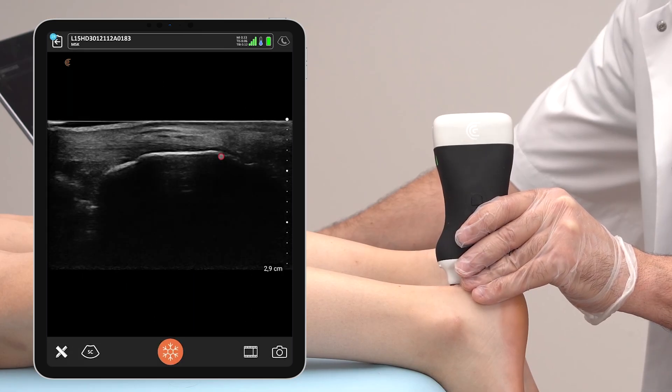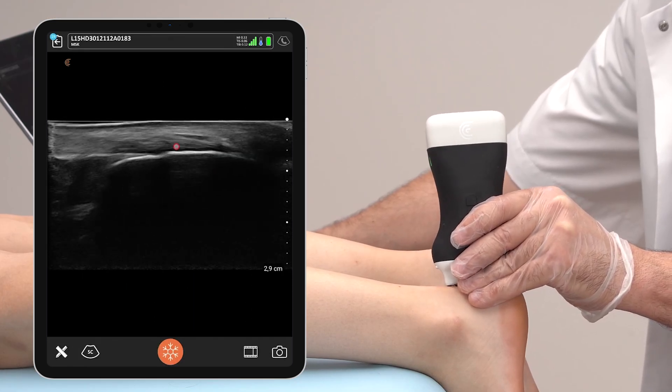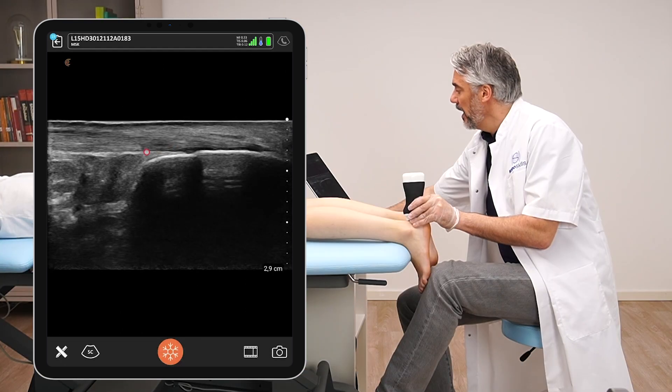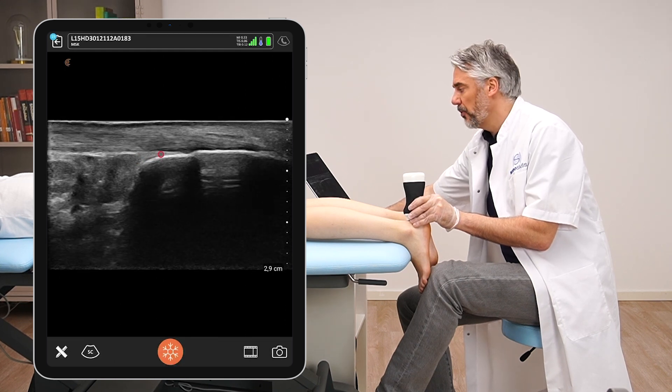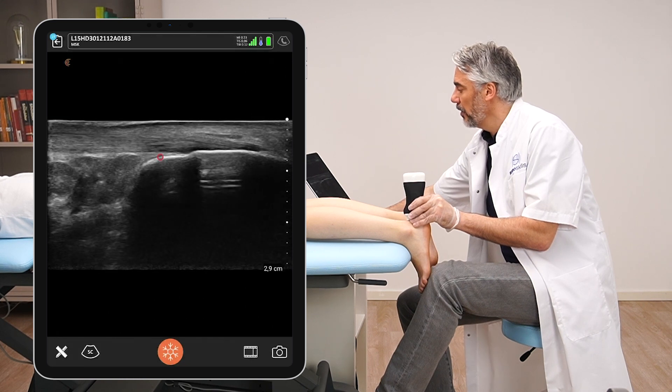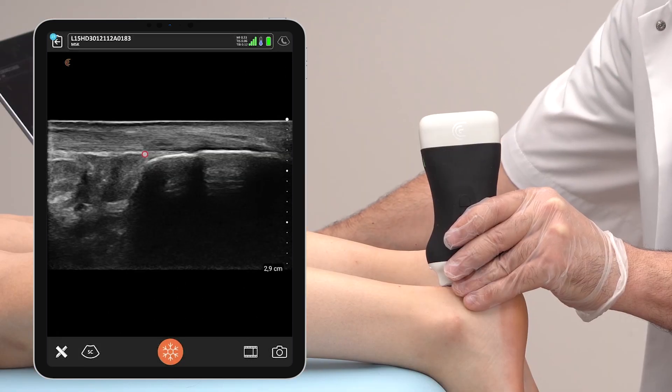Tilt the transducer from medial to lateral in order to have every fiber visualized. In this zone at the end of the calcaneus underneath the Achilles tendon there is the retrocalcaneal bursa. Sometimes you might find some physiological fluid, which would not be a problem. What would be pathological is seeing a large effusion.